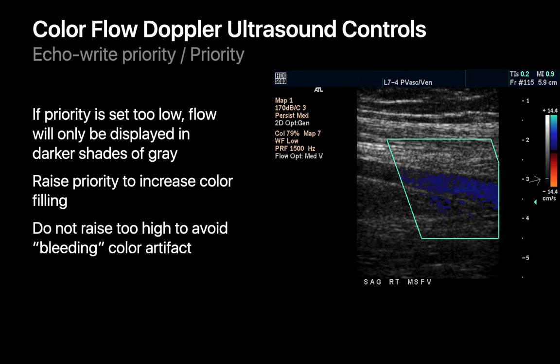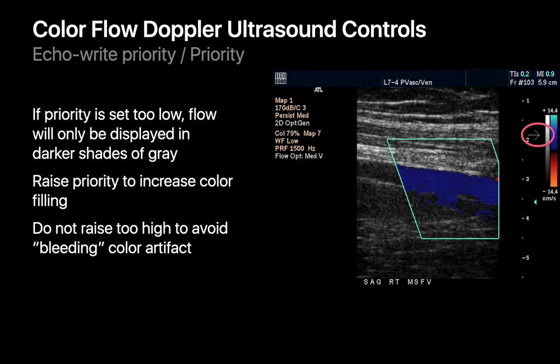Echo right priority determines which pixels of the 2D grayscale image will have color painted on them — color will only be painted on pixels darker than a particular level of gray, meaning it will not be painted atop white or relatively white pixels. The echo right priority is indicated along a grayscale bar next to the red-blue color Doppler bar. If you set the priority to a brighter pixel level, you permit color data to be written on a larger range of pixels, which can increase color filling but also risks color bleeding into adjacent non-vascular anatomy.